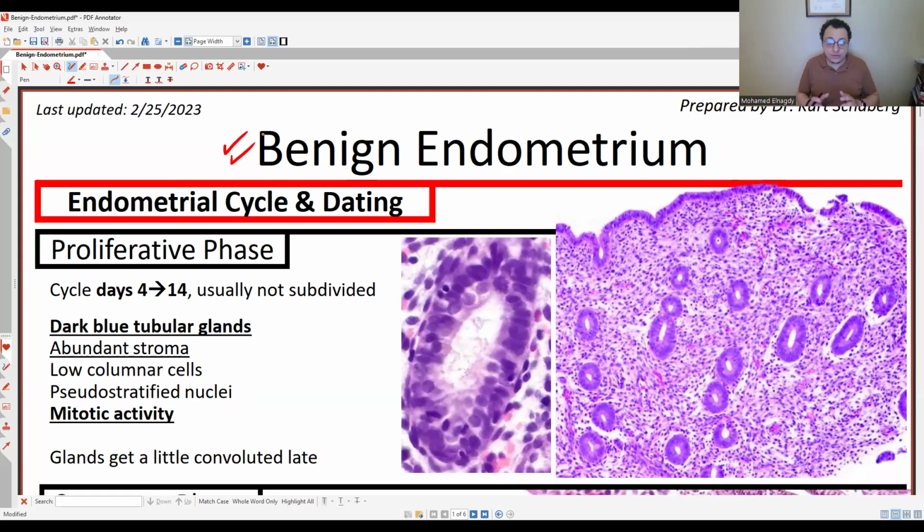before starting to talk about the benign endometrium is, when you look at any picture or any virtual slide for the endometrium, sometimes the endometrial glands catch your full attention because you are distressed and you need to reach a diagnosis right away. So you start jumping with your eyes and take a very close look only at the endometrial glands. Please make sure that you have a careful look at both the endometrial glands and the endometrial stroma.